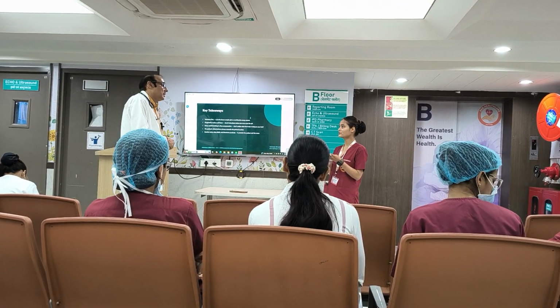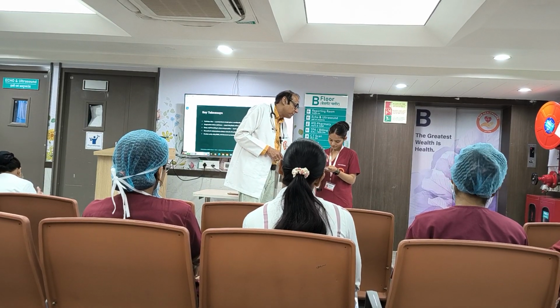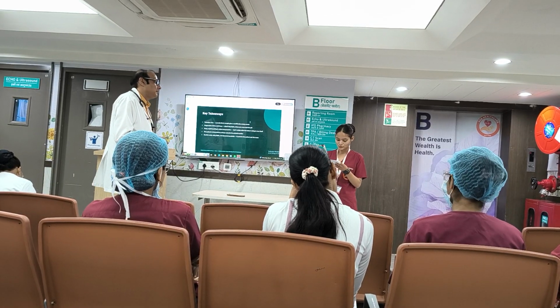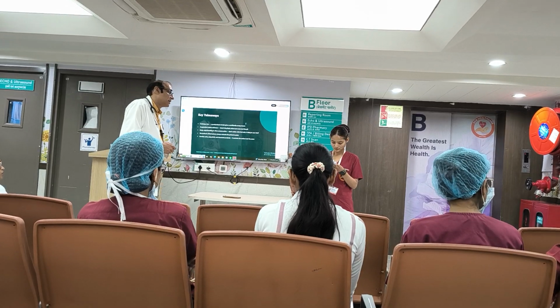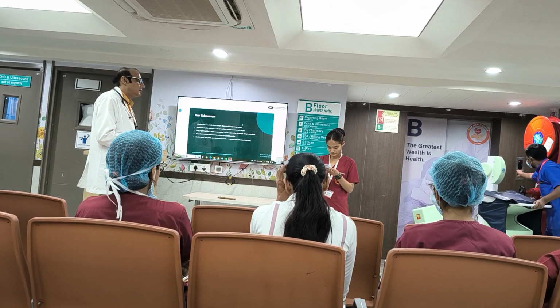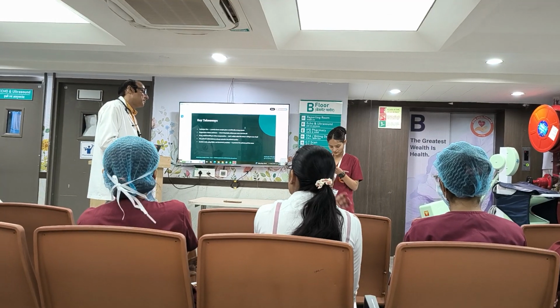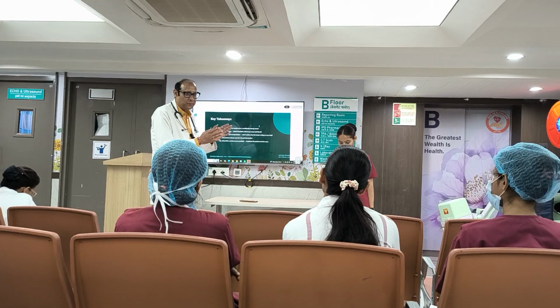That one is not a concern; you have to see the bicarb and SpO2. Bicarbonate is 21.3 millimole per liter, a little bit on the lower side. It should be like 22 to 27. And SpO2 is down, second last, 96%. So this is arterial blood gas.